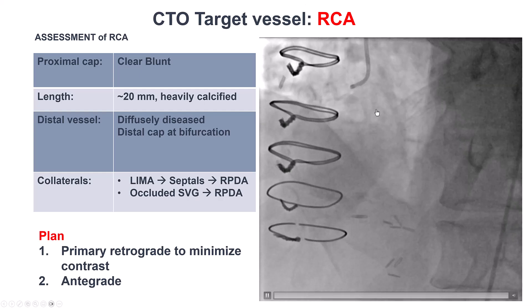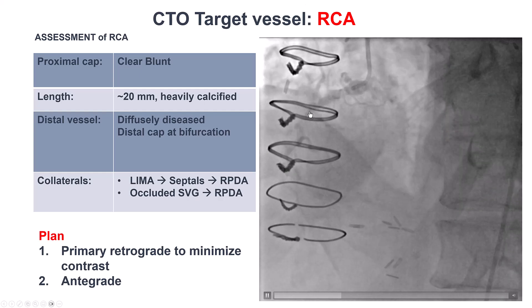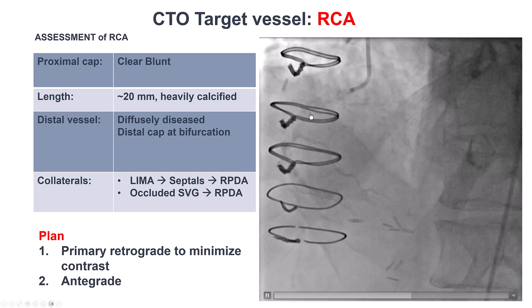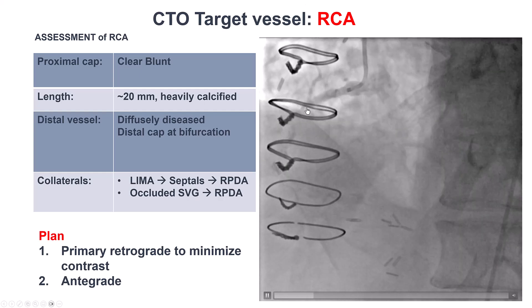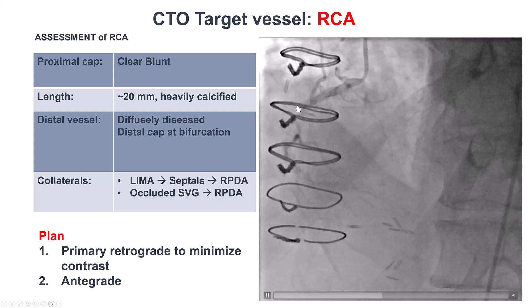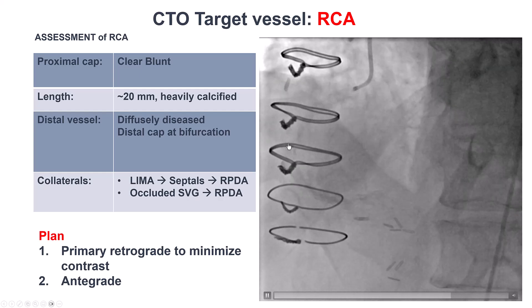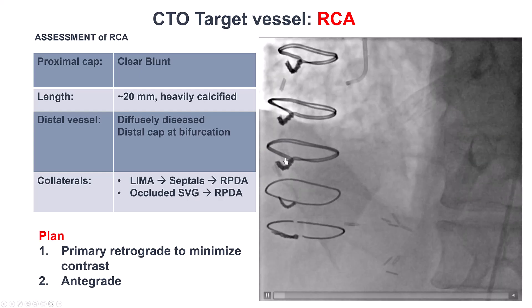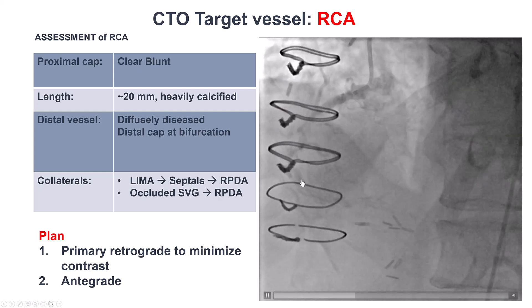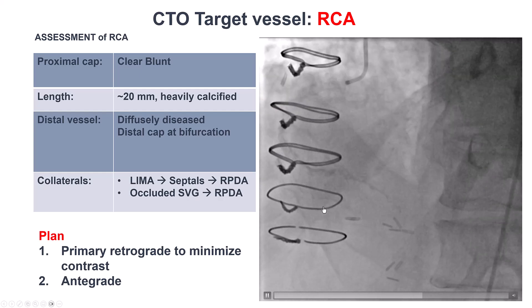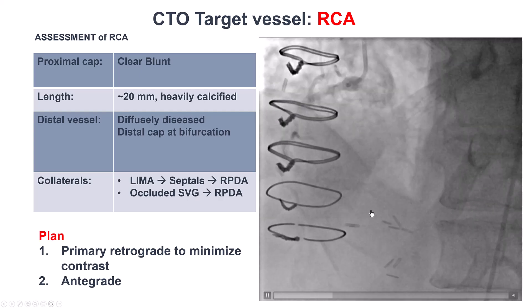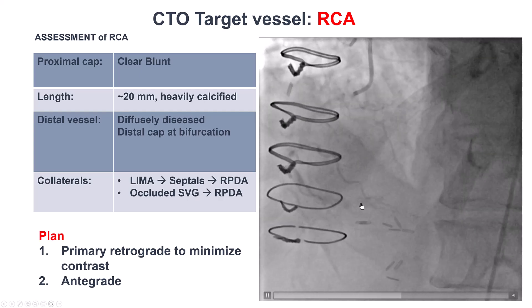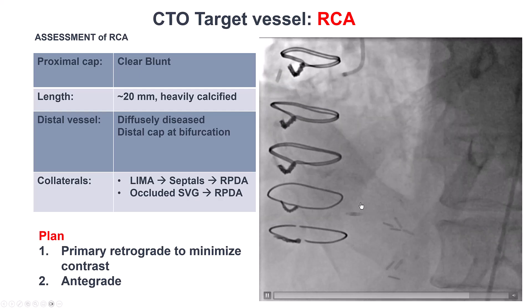The RCA has a clear cap, although it is a little blunt. There is heavy calcification. The occlusion is about 20 millimeters. The distal vessel is diffusely diseased, and there is a PDA-PLV bifurcation at the distal cap.